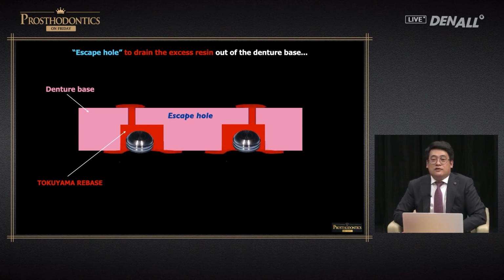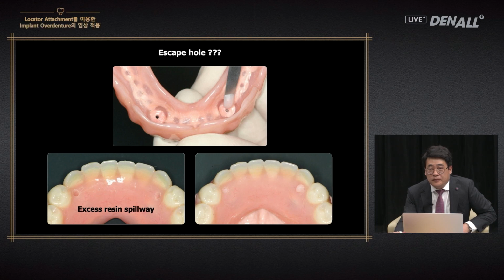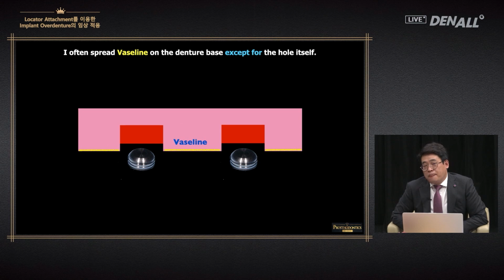When I studied, I learned to create the hole, but personally, if you do it like this and do follow-up, this area, this resin, this coloring and micro gap is formed adjacently, and food impaction can occur. I don't really prefer this. To give you a tip, when you apply resin, don't apply too much, just to put in about half.